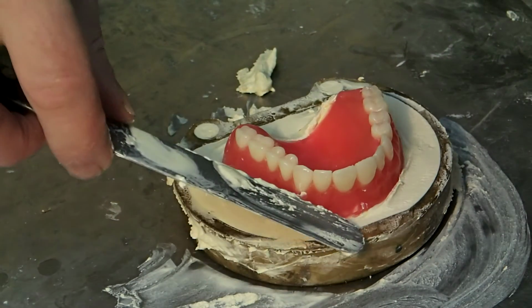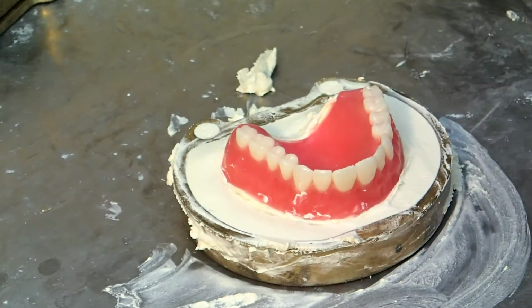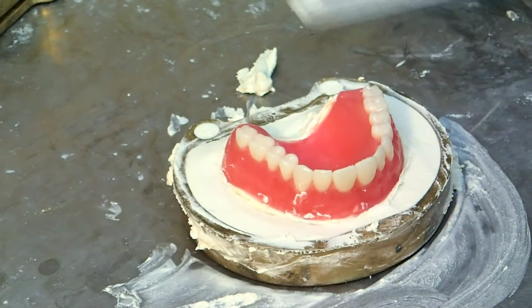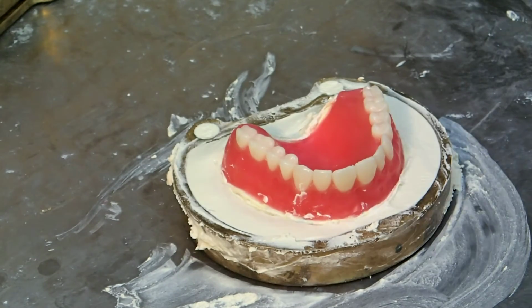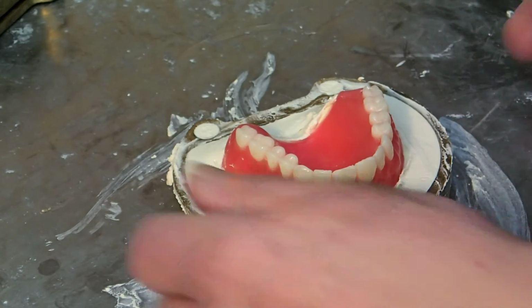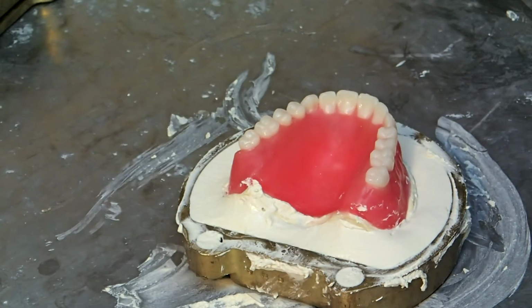This is fairly easy to control with a thick mix, and it also goes pretty fast. If you try and do this with a thin mix, the stone just keeps flowing around and it doesn't keep its shape as you work with it. Now, you want to clean this just as much as it needs. Don't play with it. As you play with it, the stone will tend to slump and change its shape, and you want it to keep this nice clean shape. I want to make sure that I don't create any undercut. So you see I've created nice rounded smooth shapes where the stone rises up to meet the model all the way around there.